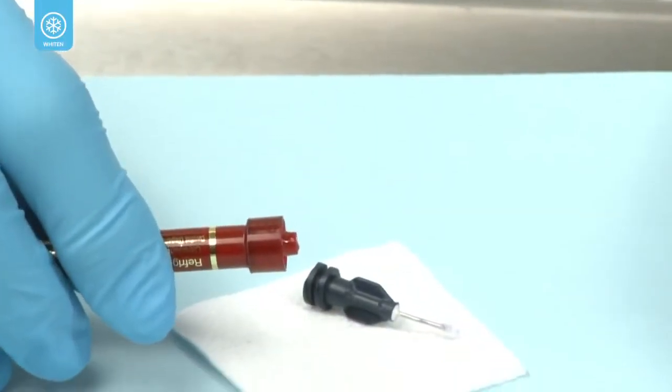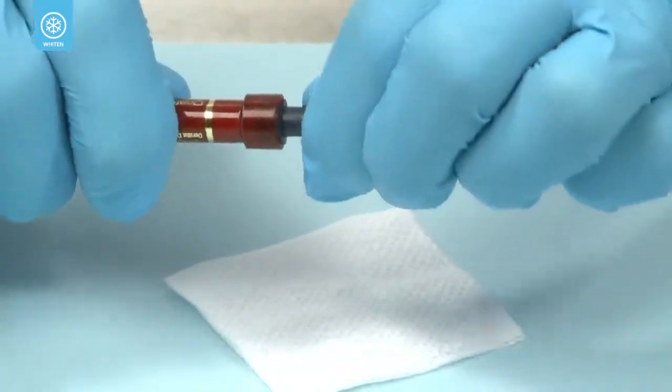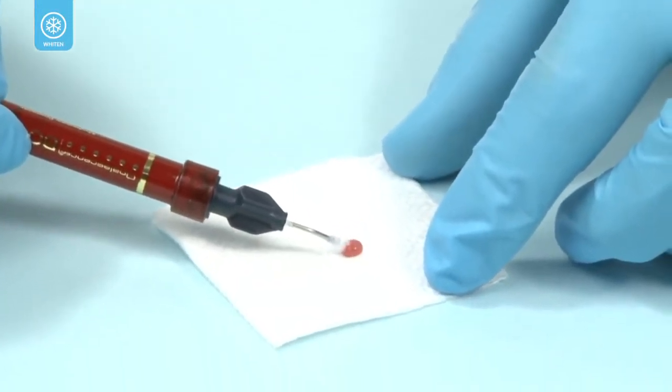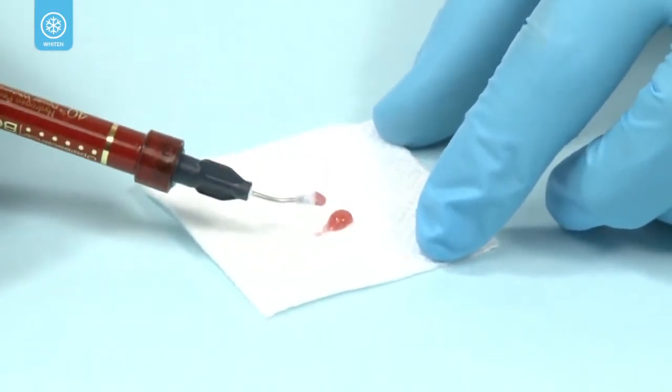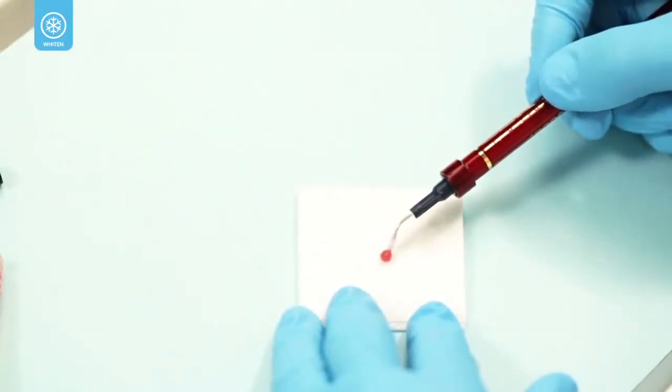Discard the clear empty syringe and attach the micro 20 gauge FX tip onto the red syringe. If you feel any resistance, do not proceed. Attach a new tip and test the flow again before applying Opalescence Boost to the teeth.